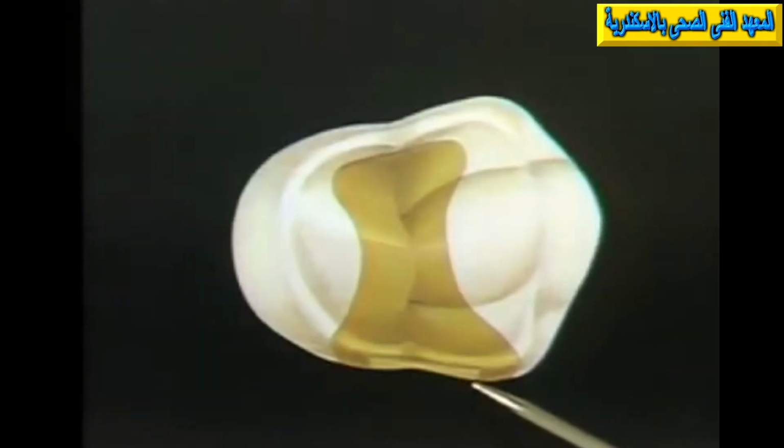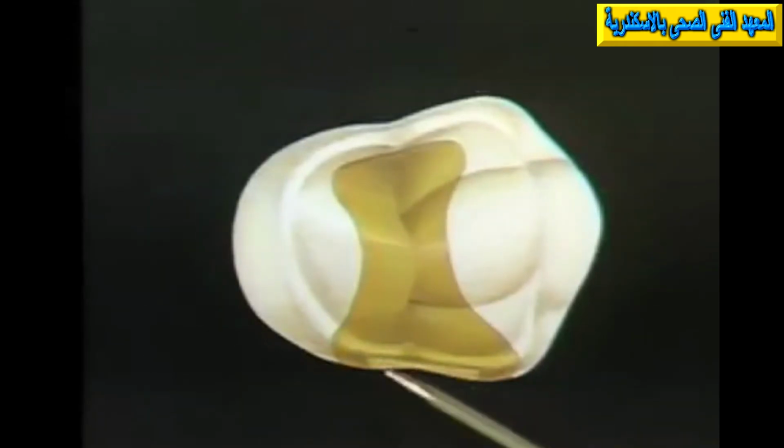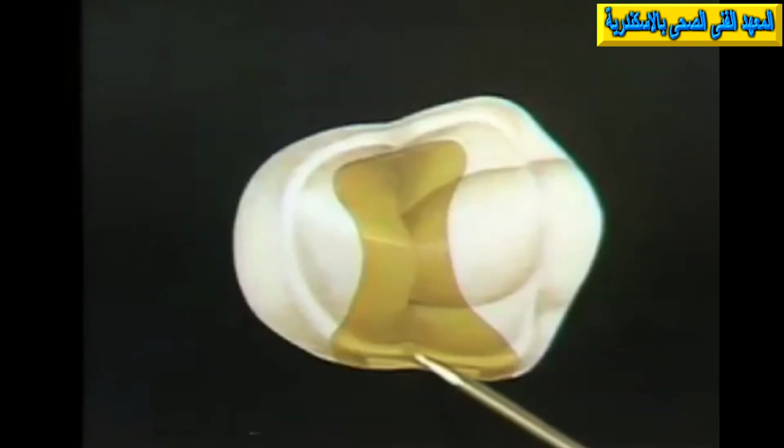Once that is cut, a 170L carbide burr is taken and placed in the central position on the flat at the necessary depth for the keyway, and a cut is made into the tooth, crossing the marginal ridge in this direction. With the carbide burr in position in this cut, an extension is made to the lingual and to the buccal to begin developing the retentive key form of the keyway.